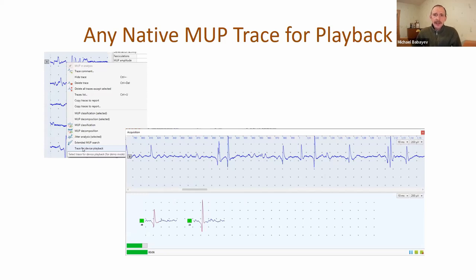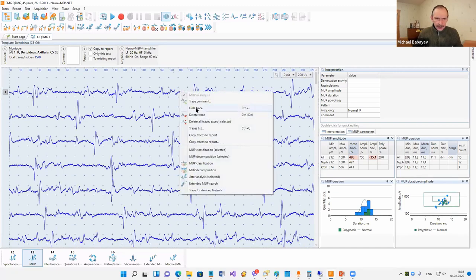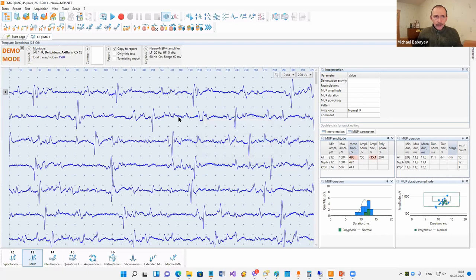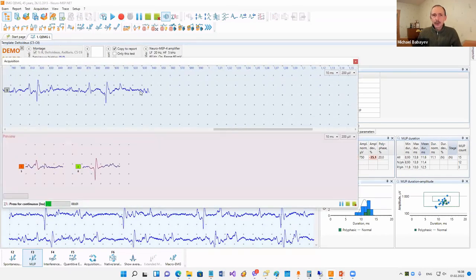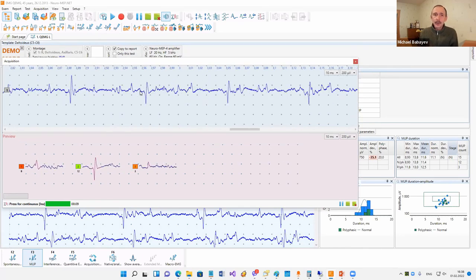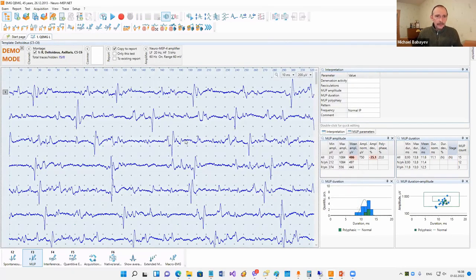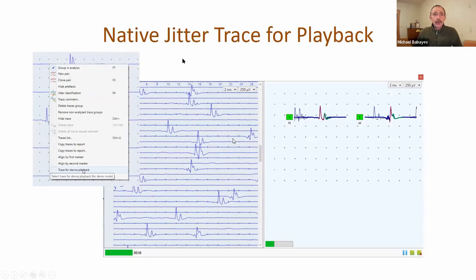Also, any native motor unit potentials trace can now be used for device playback. We can take a long trace and select from the context menu 'Trace for device playback.' When we start acquisition, this trace will be used for the acquisition. This is useful if you would like to reanalyze data or make a demonstration. In the jitter test it's also possible to take any long trace for playback, select it, and start this emulation of a real acquisition.